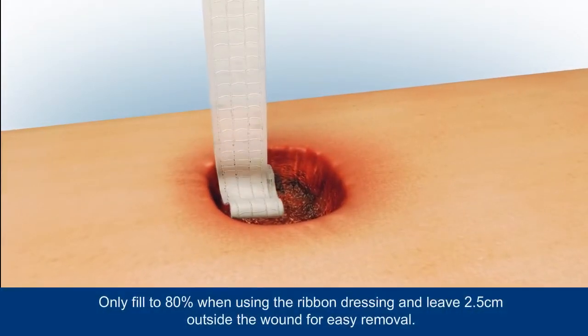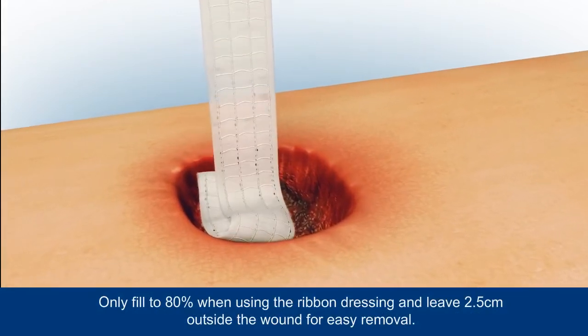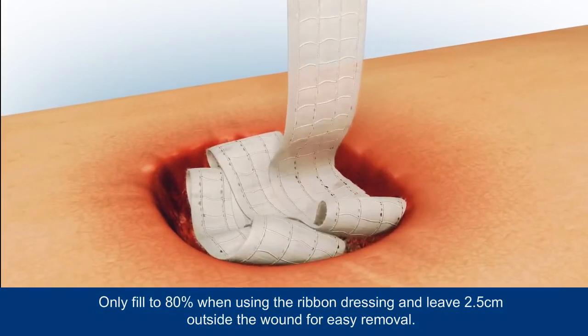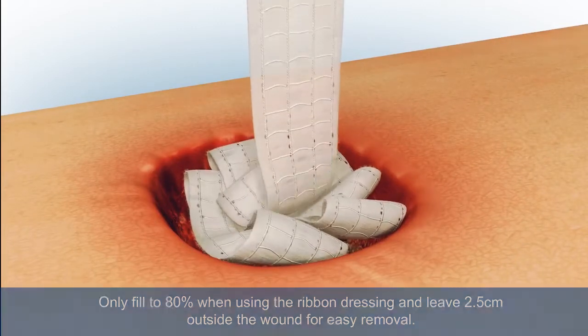For wounds greater than 0.5 centimeters in depth, Aquacel Extra or Aquacel dressings can be used as a filler. For example, when using the Aquacel ribbon dressing, only fill to 80% and leave 2.5 centimeters outside the wound for easy removal.